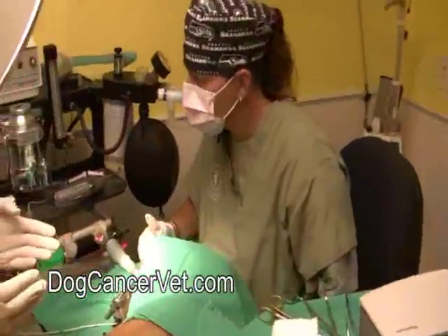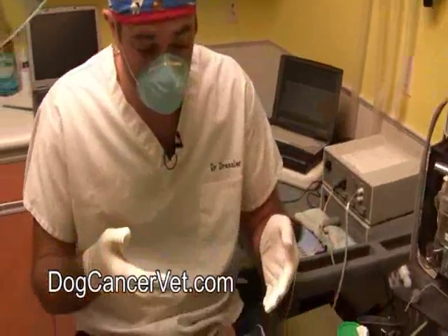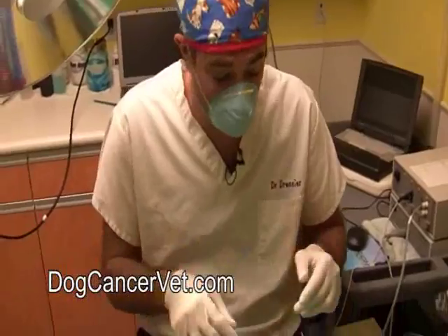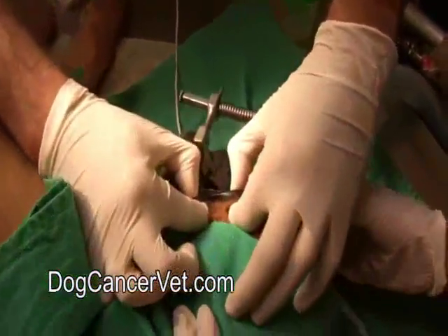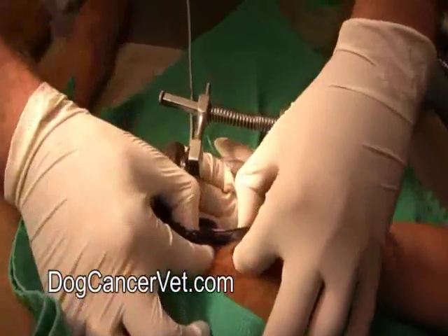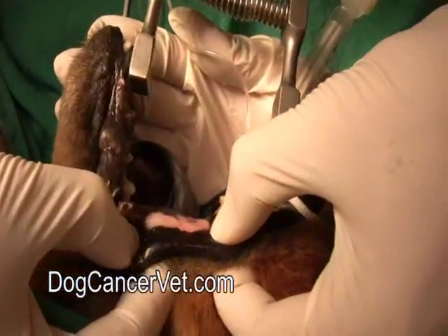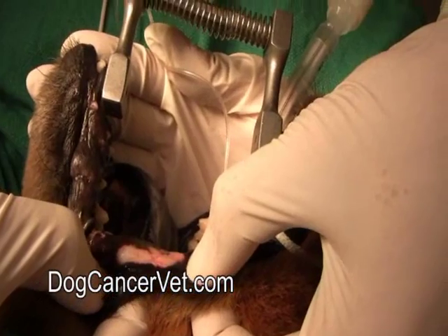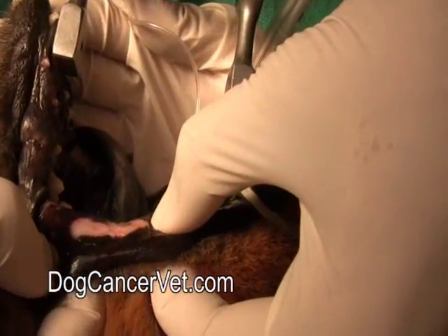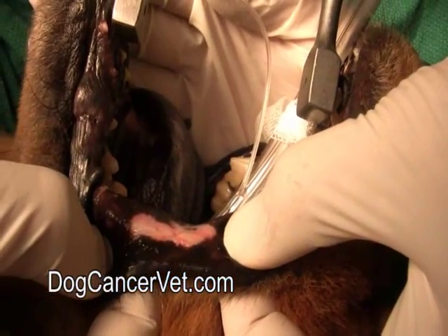It's non-sterile because the inside of the mouth is a dirty area, so we don't have to worry about keeping a sterile field because it's impossible to sterilize this area. Anyway, we're going to get going right now. So what we're looking at over here is we're going to be biopsying this lesion right here, which is on the inner surface of Bjorn's left cheek. If you take a look at it, you can see that it's ulcerated, it's depigmented. Ulceration just means that the surface is kind of like a crater, and depigmentation means that it's a different color compared to the rest of the area that it's around.